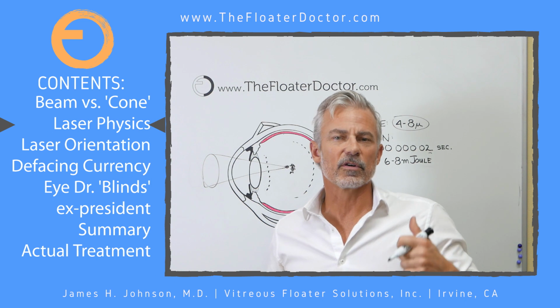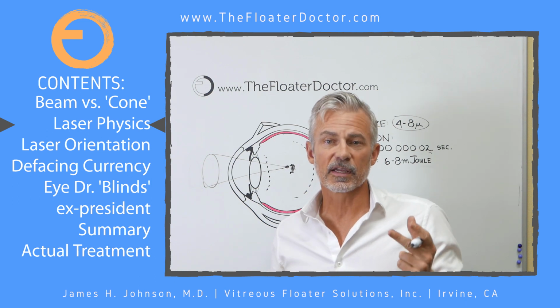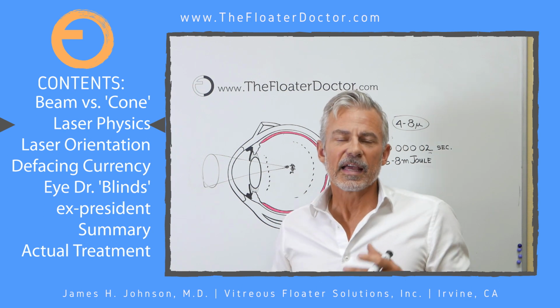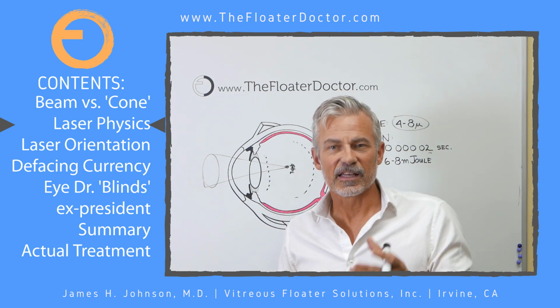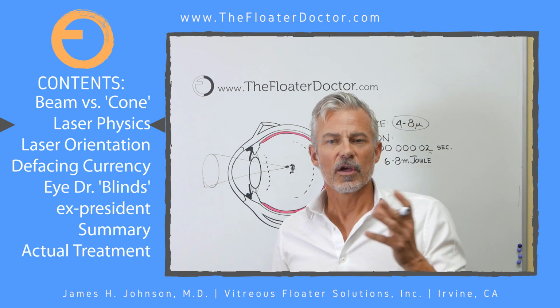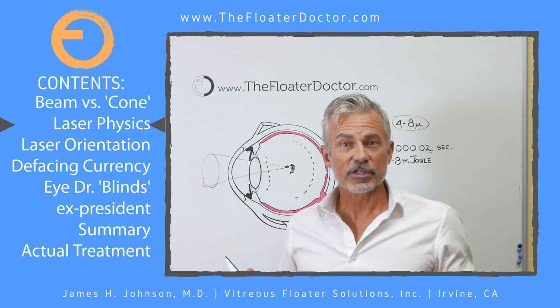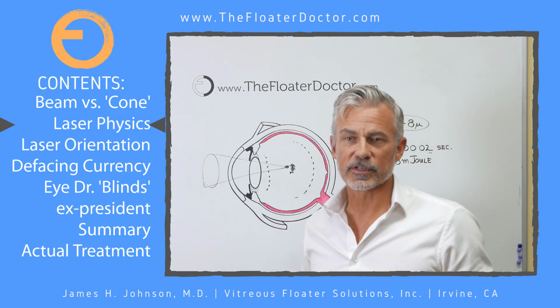You're getting, some of those are photochemical, some are thermal, some are thermoacoustic. There is this electromagnetic optical field breakdown effect. Essentially, we are ionizing, that is, vaporizing and destroying those protein molecules inside the eye, which is kind of cool because you don't want those floaters there.